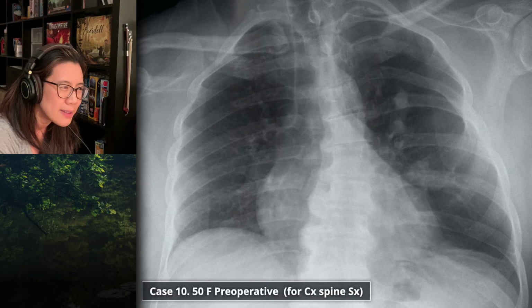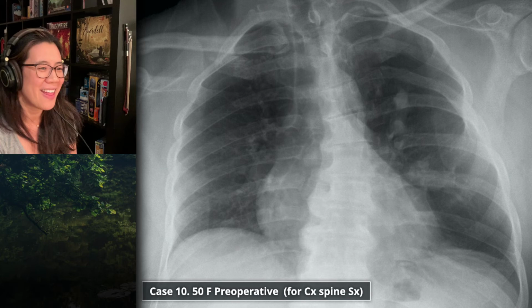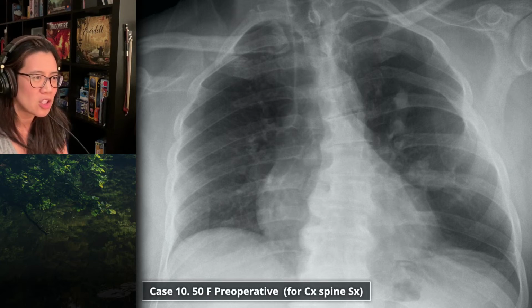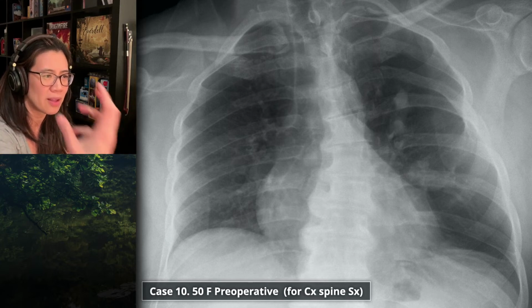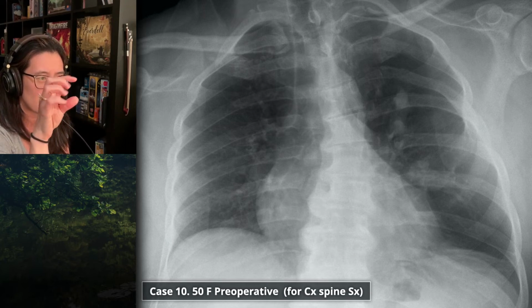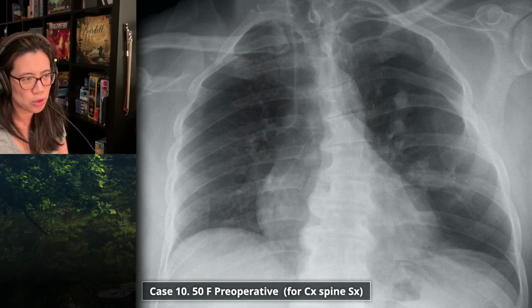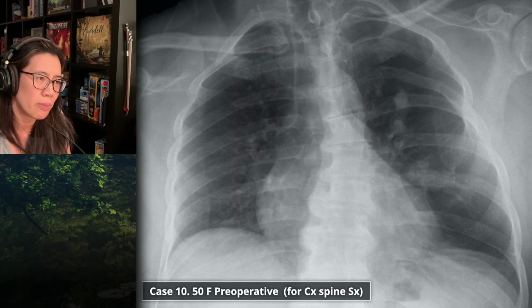I'm struggling here. What do you think of the pulmonary vascularity? Yeah, actually, I was going to comment that the central left pulmonary vessels are very prominent. Initially, when I first looked at it, I thought they were granulomas or something, but actually I think they're pulmonary vessels end on, and I think they're too big on the left. Centrally they're big, but peripherally it's quite pruned. So peripheral pruning, but asymmetric peripheral pruning.